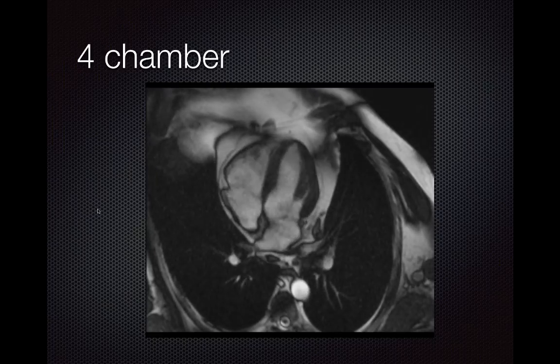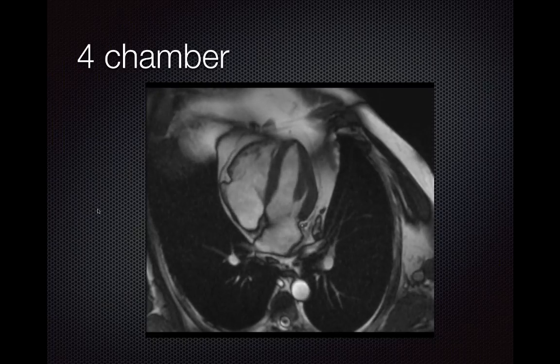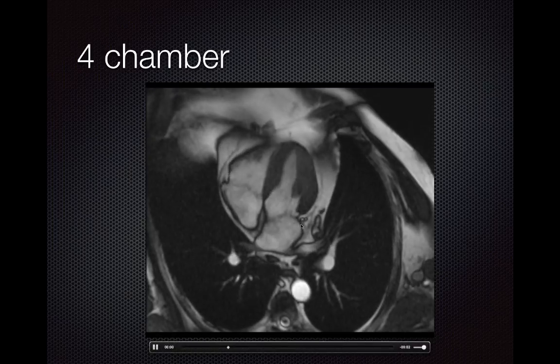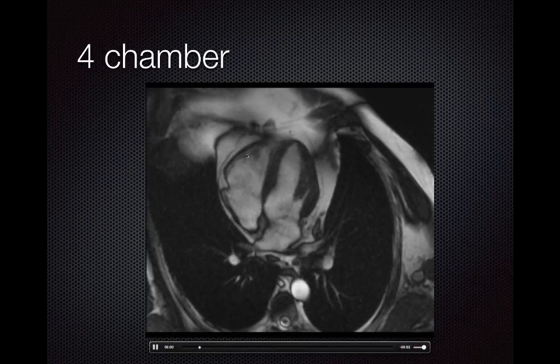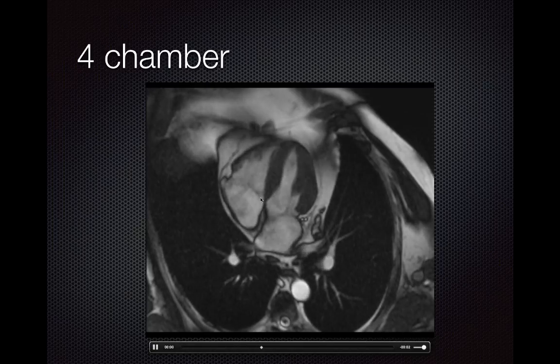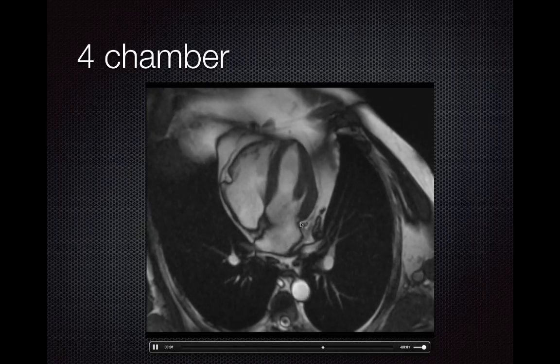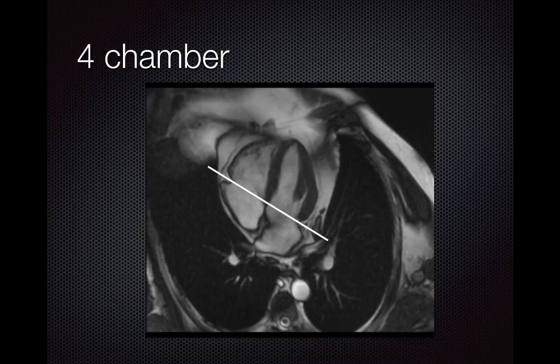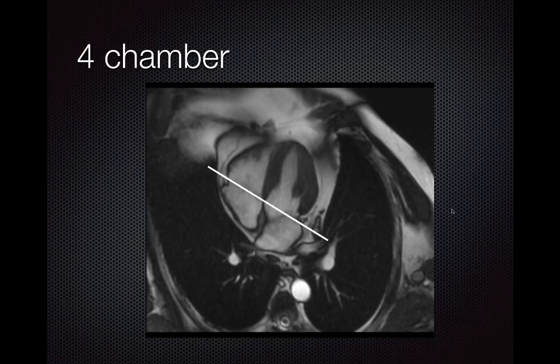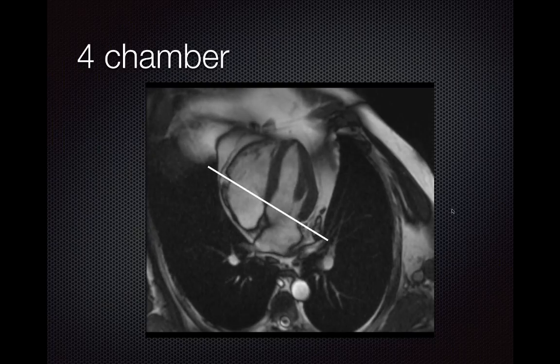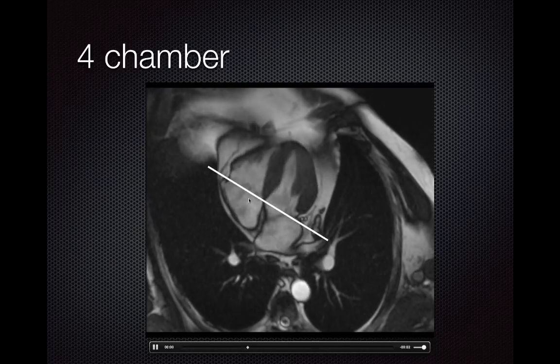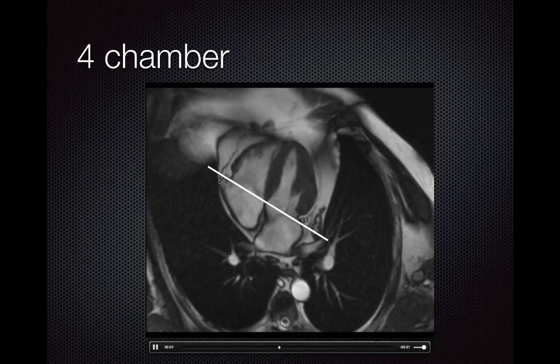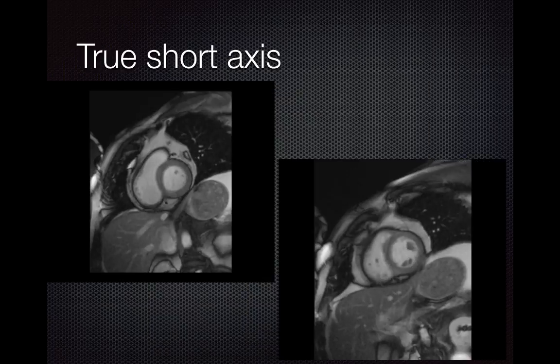Here's our four-chamber view as a cine image. You can see very nicely the LV, left atrium, RV, and right atrium, with the tricuspid valve and mitral valve clearly visible. From this four-chamber view, we set up our short-axis stack for functional evaluation, lining up along the valve plane going across from the mitral valve to the tricuspid valve. Two representative short-axis images are shown: one more toward the base with early papillary muscle visibility, and one mid-to-apical showing the papillary muscles very nicely.